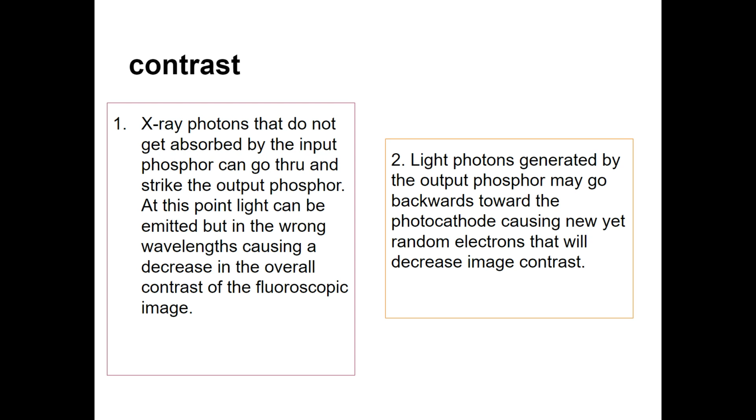You don't know. But if it's a video, then you see the blood either going up or down. And in a cardiac study, if you have something like regurgitation, where blood flows through but some of it goes back, which is bad, you can't see that on a static image. But on a dynamic image, those are the kinds of things that you can see, which could be really important to the patient. They might need surgery or a new valve replacement.